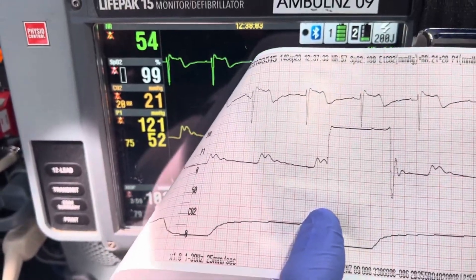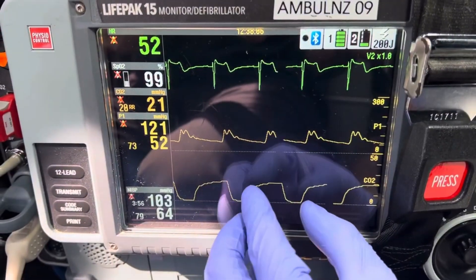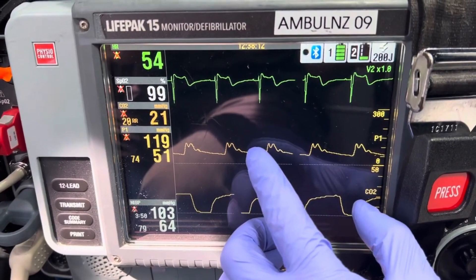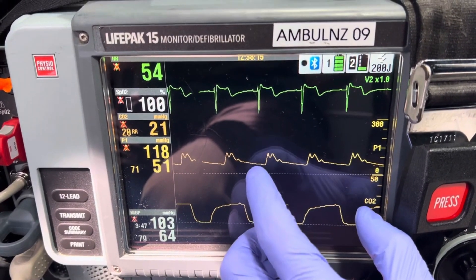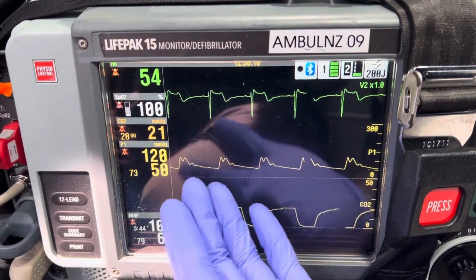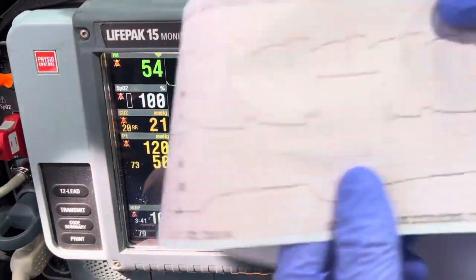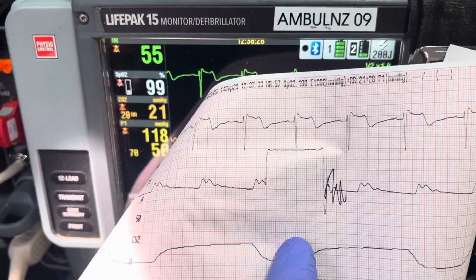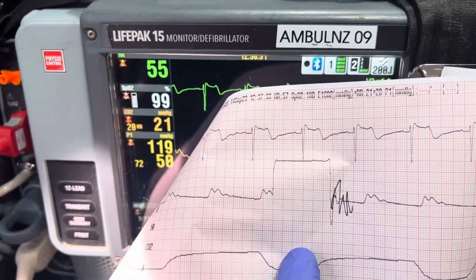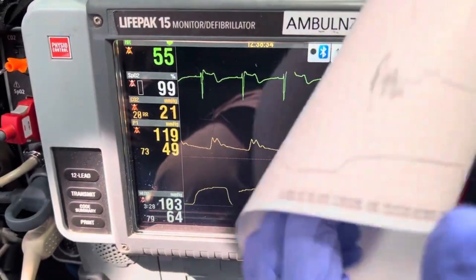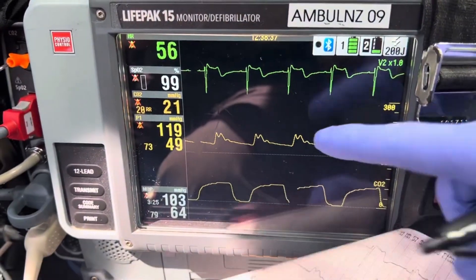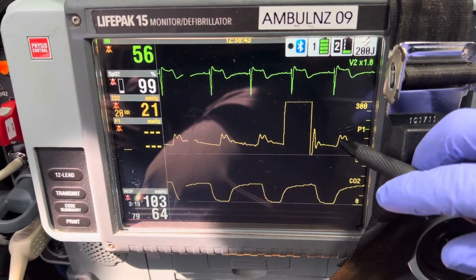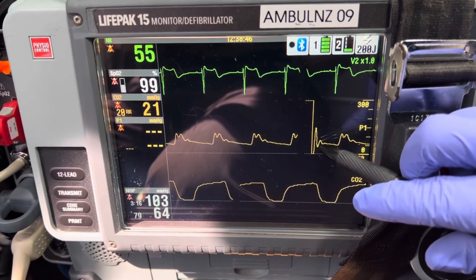What happens if you're overdamped? You probably have a clot in the line. Your waveform loses the dicrotic notch — usually a clot or air bubble. If you're underdamped, you have falsely elevated blood pressure and you'll see a lot of spiky lines — like seven of them. Overdamped means clot or air bubble; underdamped means a lot of oscillations. Let me do it one more time — fast flush — you see two oscillations right here. So we're perfectly good, properly damped.